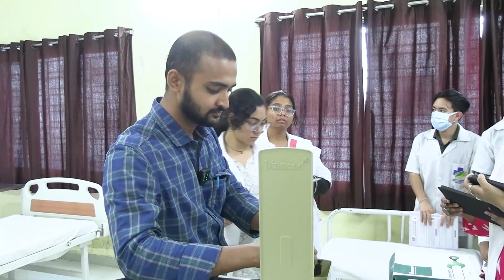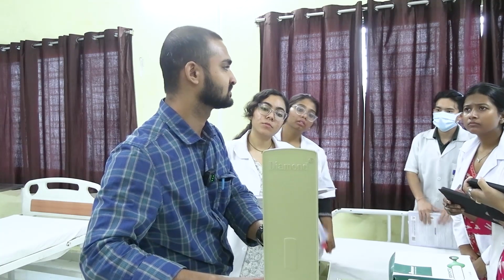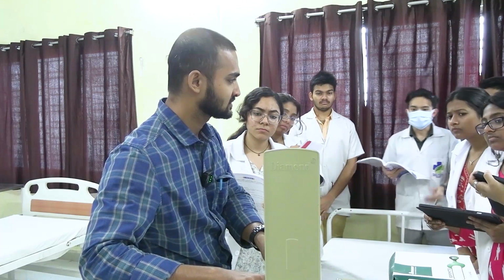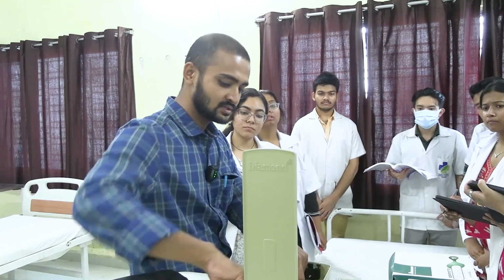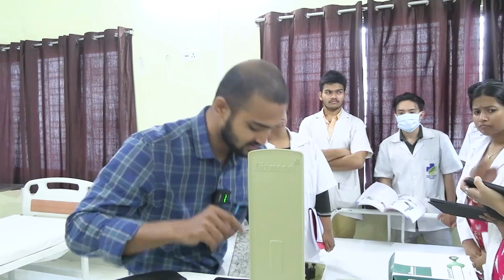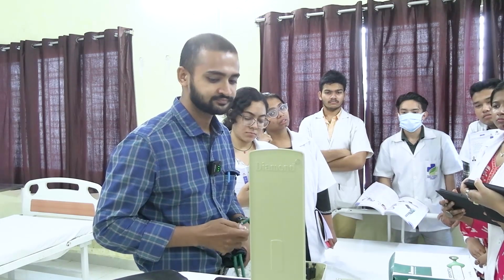This tube is connected with the mercury reservoir, and again this is connected with a lock. This is off and this is on. When it is longitudinal, it is off, and when it is horizontal, it is on. Now if I press the valve, it will rise, isn't it?